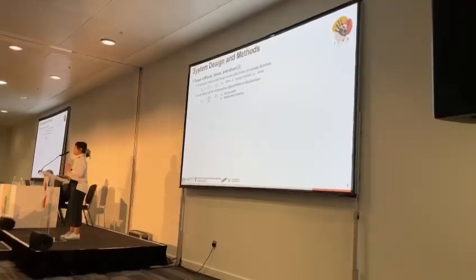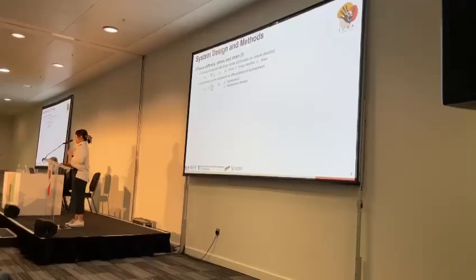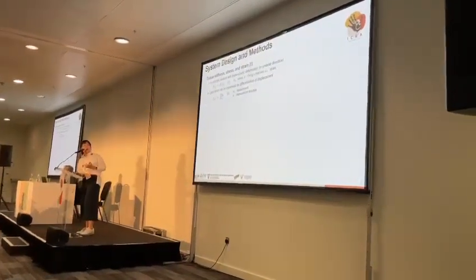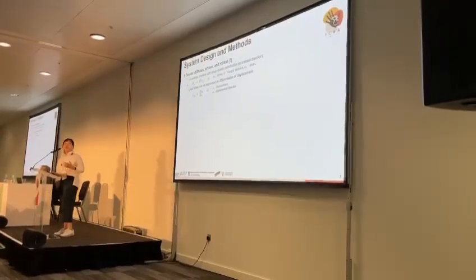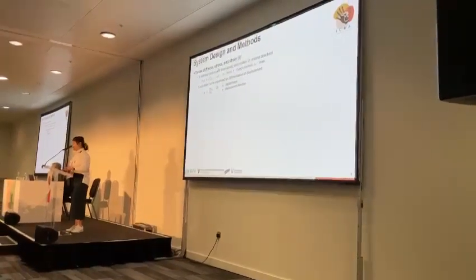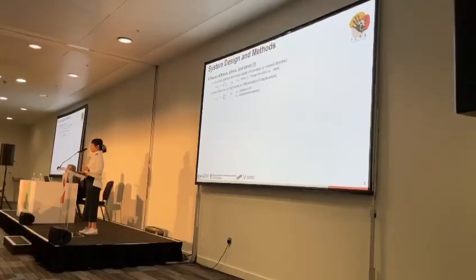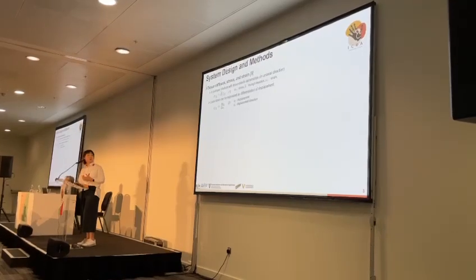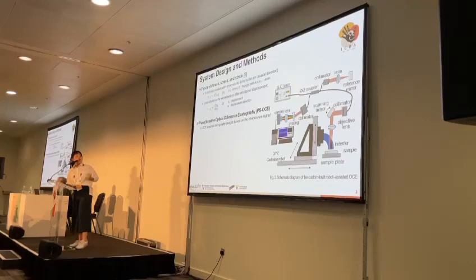The relationship between stress and strain in an isotropic medium with linear elastic deformation for uniaxial direction can be simplified as equation 1. Here, when uniform stress is applied to the sample using the robot, the strain shows a mechanical property of tissue. In uniaxial direction compression and displacement, the strain can be expressed as a partial differentiation of displacement. To estimate the strain, we use the OCT system.